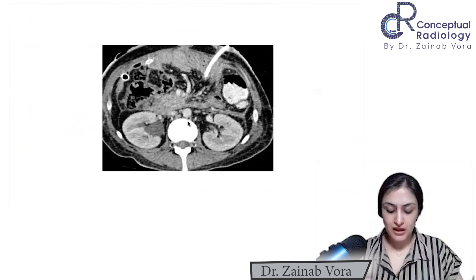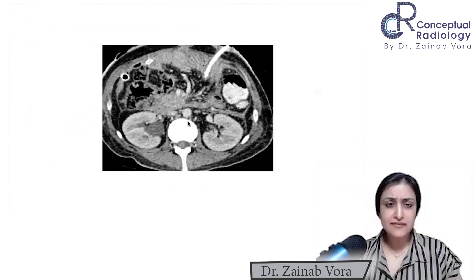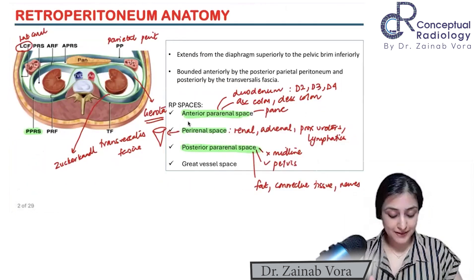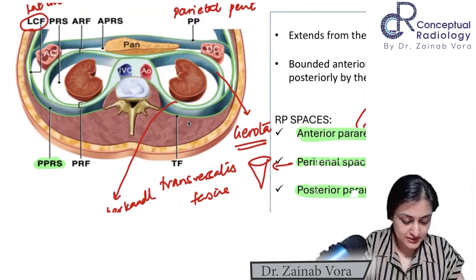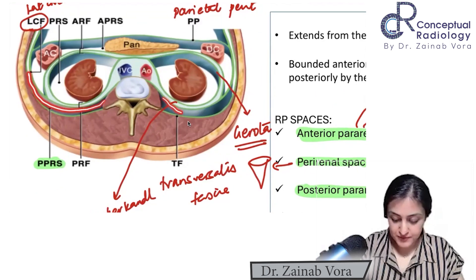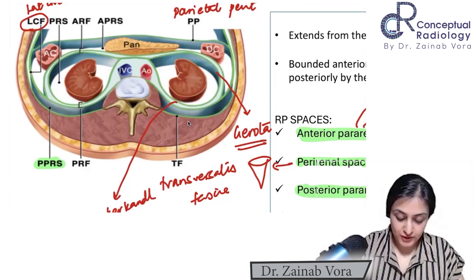Now, how do we look at these spaces on a CT? Normally you will not see the fascia, but you can see it when it's thickened. I'll show you — here is the posterior pararenal space. Can you see this? This is the posterior pararenal space.